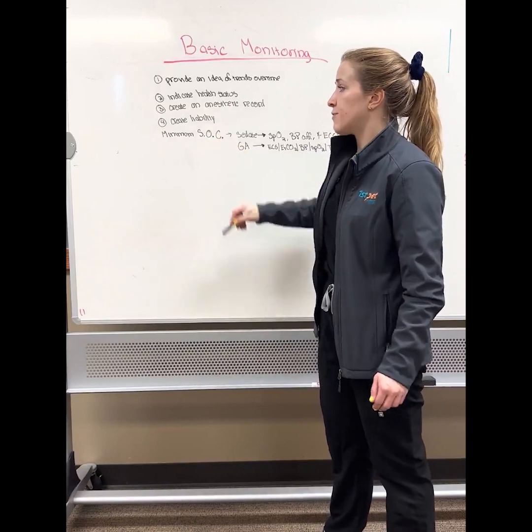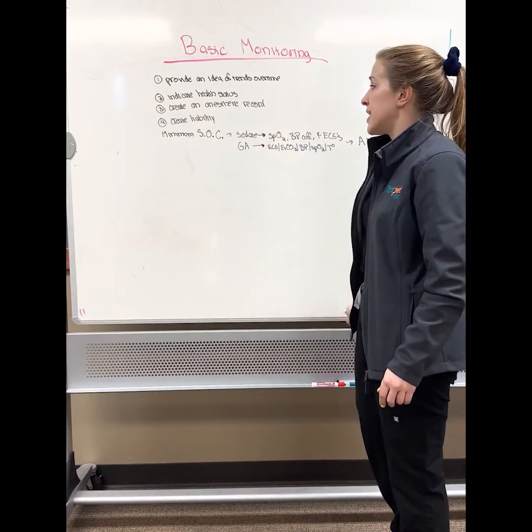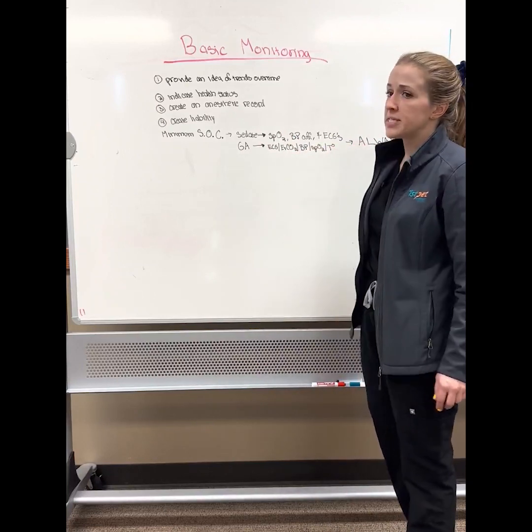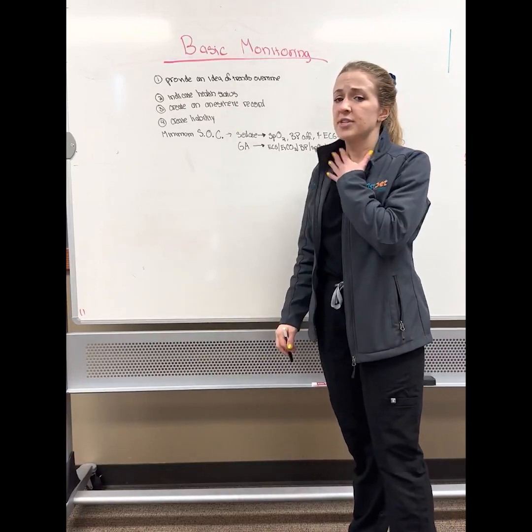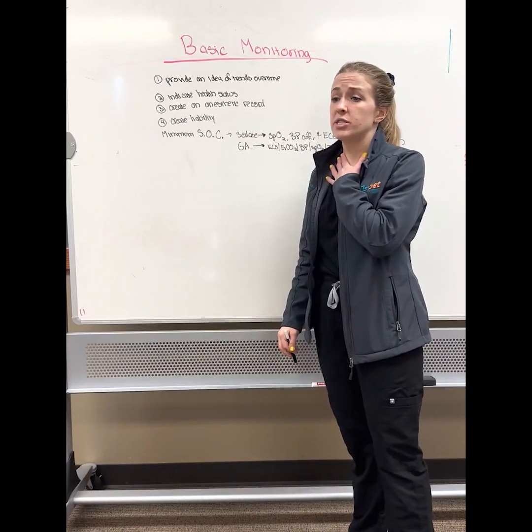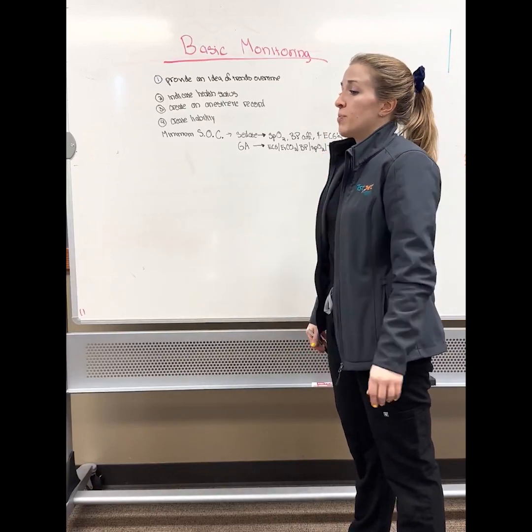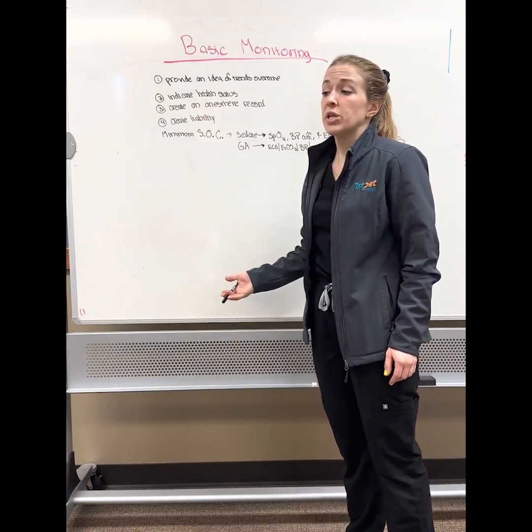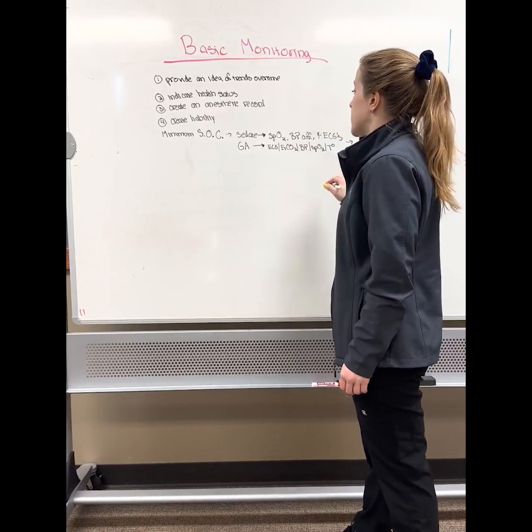Minimum standard of care for sedated and anesthetized patients when it comes to monitoring. When you have a sedated patient, I want you to put on a pulse ox, a blood pressure cuff, and probably some ECGs if you can stand it. Lots of sedated animals have dynamic airway collapse, and they are going to need oxygen support. Lots of animals, when they're sedated, their blood pressure might either get really high if they get alpha 2s, or it might get really low if you ended up using alfaxalone IV. So just keep that in mind.